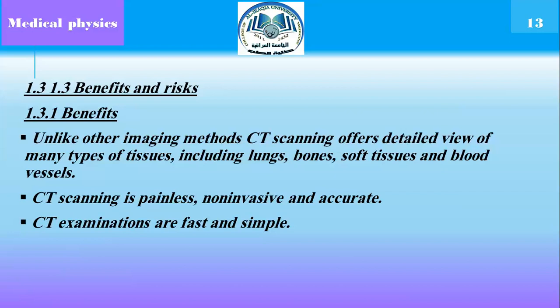Benefits and risks of CT scan. First, we will talk about the benefits. Unlike other imaging methods, CT scanning offers a detailed view of many types of tissue, including lungs, bone, soft tissue, and blood vessels.